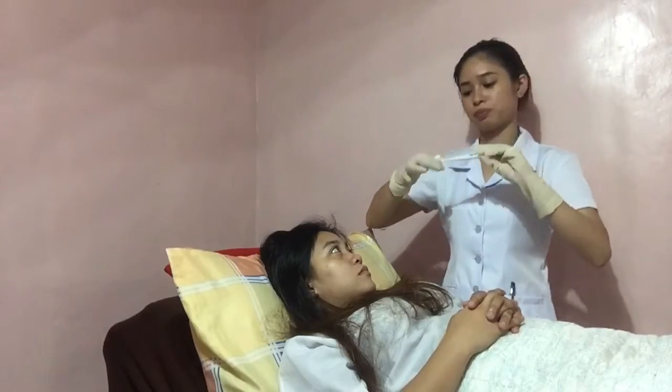So place the client appropriately. Wipe the tip of the thermometer using the alcohol swab in a firm twisting motion prior to its placement, from stem to probe. So place the thermometer, and now I'm going to perform the oral method. So place the tip of the thermometer in the side of the frenulum. So Althea, can you open your mouth and raise your tongue? Okay, so I'm going to put this, then close your mouth.